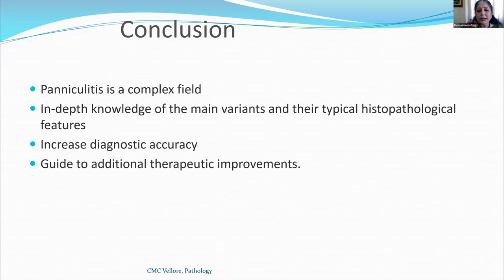So I'd like to end by telling you that panniculitis is a complex field where an in-depth knowledge of the variants and their typical histopathological features are necessary, so that you can increase the diagnostic accuracy of what you would give in your report, and to help the clinician to give a better treatment.